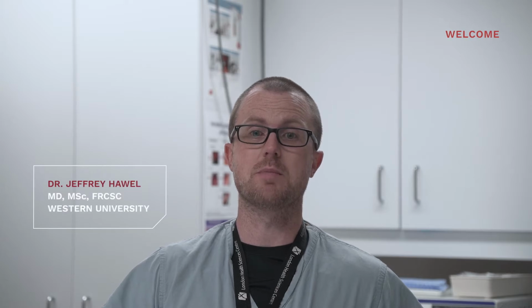This video will provide a basic overview of the technical and anatomic considerations necessary for safe and efficient colonoscopy. For anyone new to learning colonoscopy, or anyone who remembers when they first learned, I don't need to tell you that colonoscopy is difficult and humbling, even for those now with years of experience. For surgeons, it is a very different skill set from open surgery or laparoscopy.